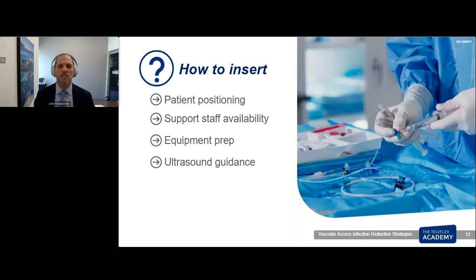Make sure you have support staff available. If you drop something and you need someone to get something, if the patient might be moving a little bit and you need an assistant to help hold them down, if you need to give them a little extra sedation or whatever the case may be, it's essential that you have the appropriate personnel to assist you. Prep your equipment.